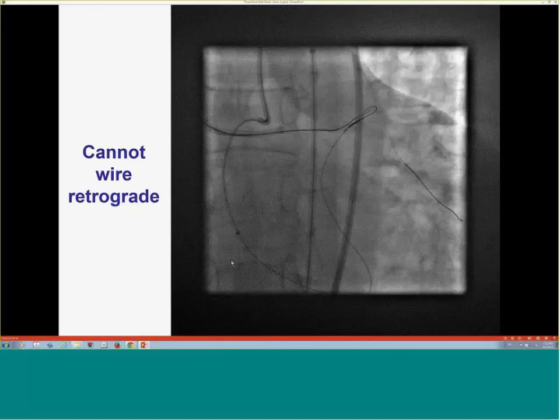And again, the difference, I think here, normally when we do escalation, we start with an XT and then we'll go Pilot or Pro 12. I think now the algorithm is changing with the Gaias, and we're using much more early the Gaia wires versus using Confianza Pro 12. It seems a little more torqueable, and it retains its shape a little better than the Confianza Pro 12. I don't know if you had it already or if you're using them, but there seemed to be a major improvement forward.